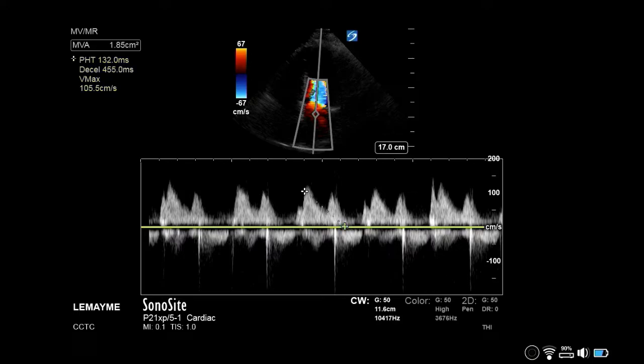You can see in the top left of the screen that the machine is using this same slope to calculate both pressure halftime and deceleration time.